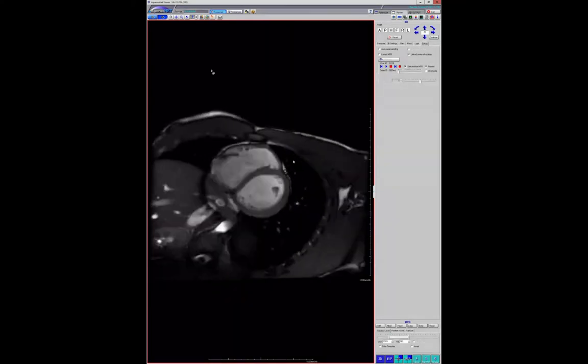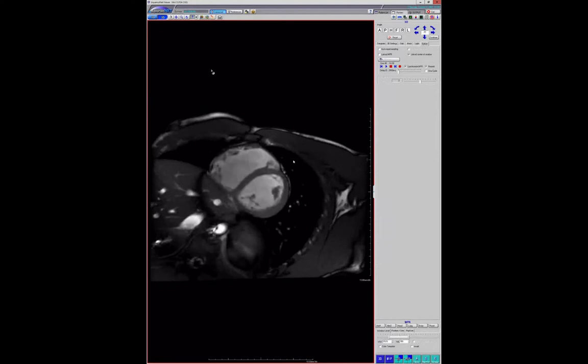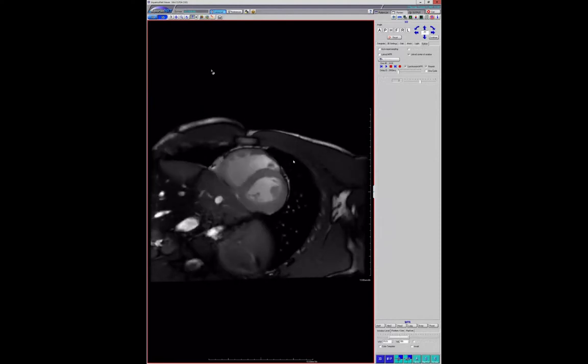So right away, you know this guy is in pretty darn good shape, and is going to have a very large heart for his water polo playing. His EF was on the lower side of normal, which we also see in endurance athletes. That's not that fascinating. What I did find fascinating, and I hope I can find the right sequence without wasting everyone's time here, because it shows up like this on my, that sure isn't the right sequence.